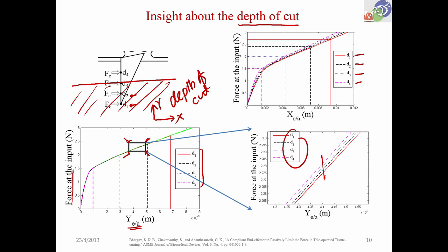So, we are not actually measuring displacement here, we are measuring at some other point and the mechanism as we explained in the previous slides. So, if we know the displacement, let us say I have some displacement value here, then depending on the depth of cut, I would know what force it is. Okay. So, that is how it is going to work in terms of the force sensing as well as limiting.